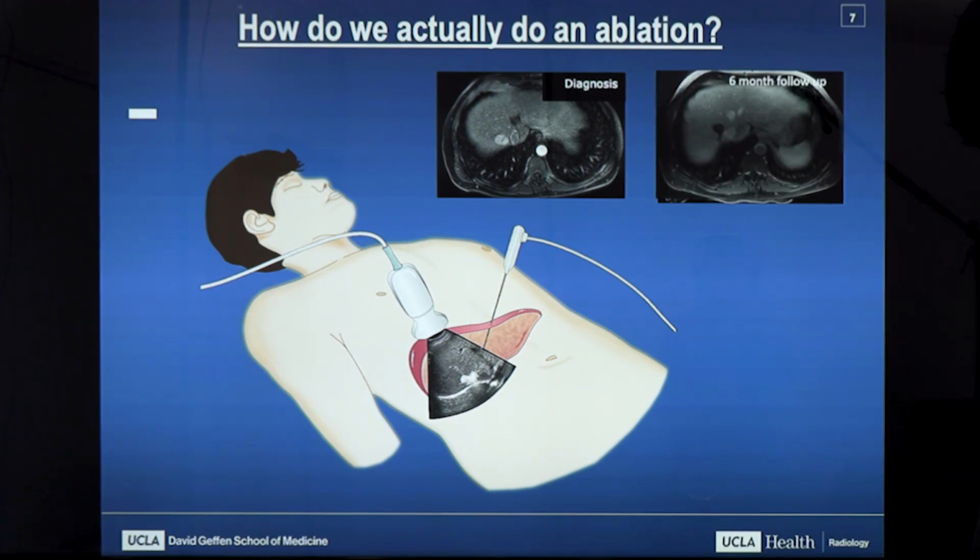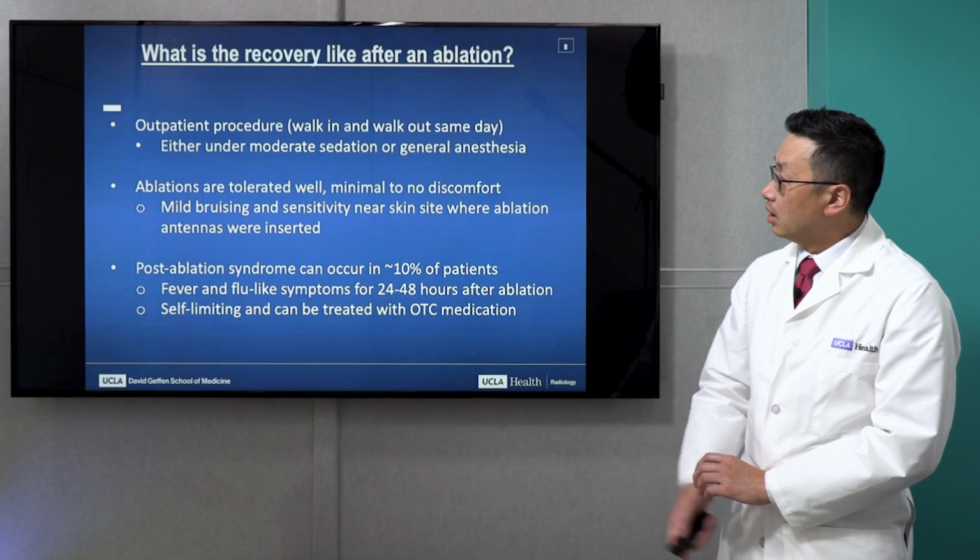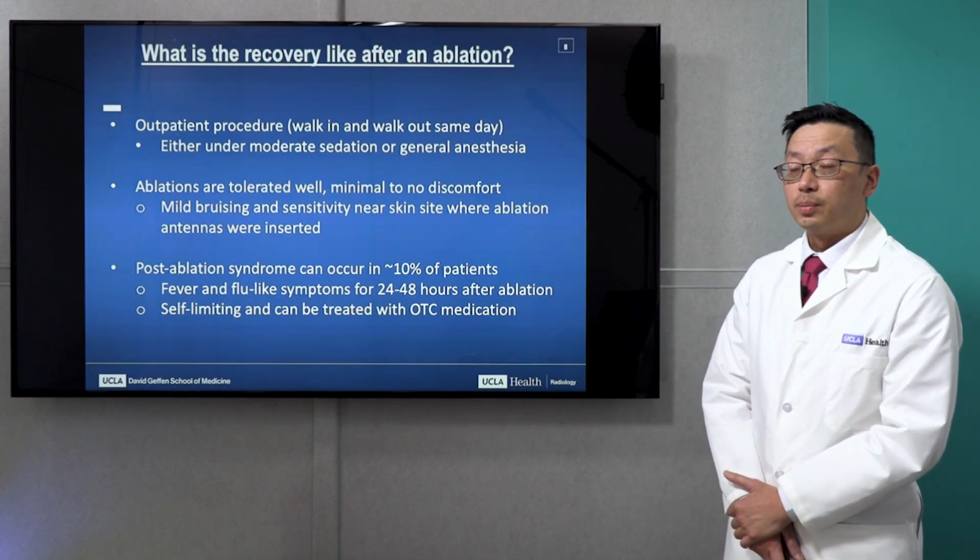What happens to the ablation zone? Well, normally what we see is that the ablation zone involutes on itself, and at the end it just becomes scar tissue. What's the recovery like after an ablation?